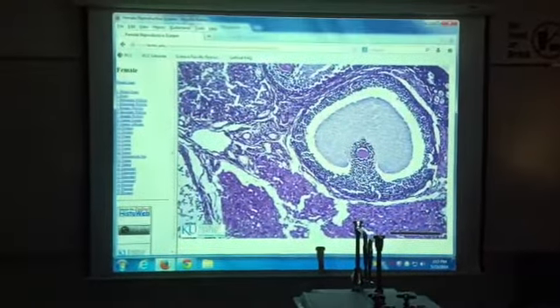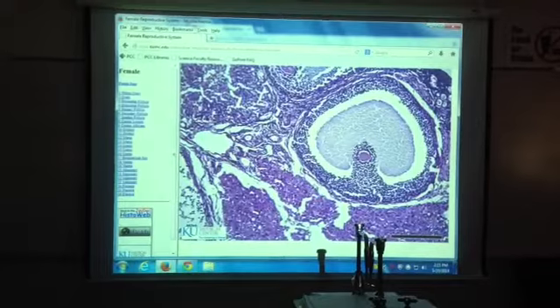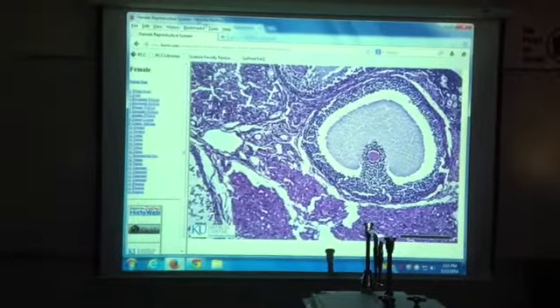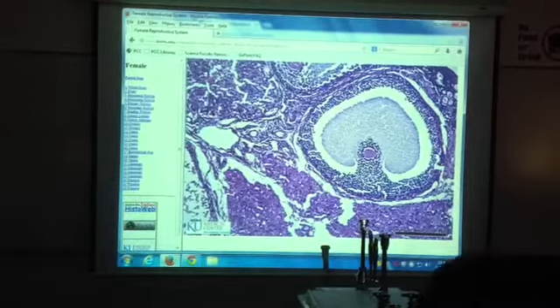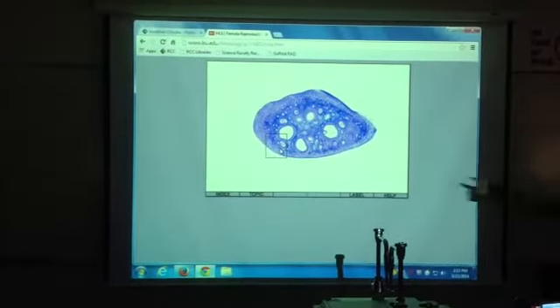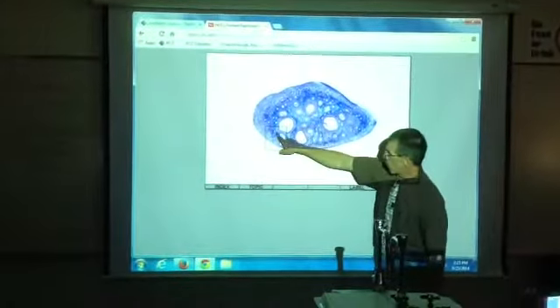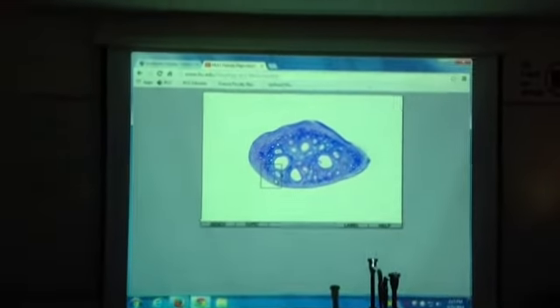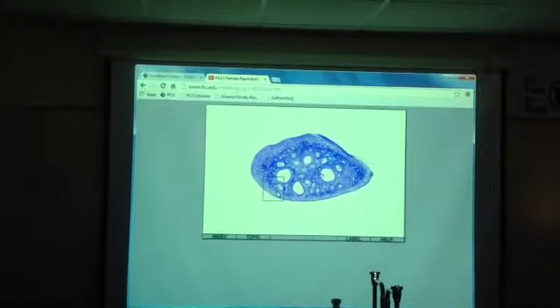Is there a picture that has all of them compared to each other? On the poster. So the poster is going to be your friend. So let me do, if I can get Boston to work for some reason, you can zoom in, but it doesn't want to zoom. I can't get the zoom to work anymore, but they used to have a really nice one if you go right here. Primordial, primary, secondary, vesicular, all in one little scan. But it won't zoom in anymore. I don't know. Damn it.